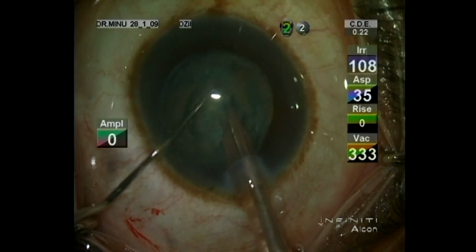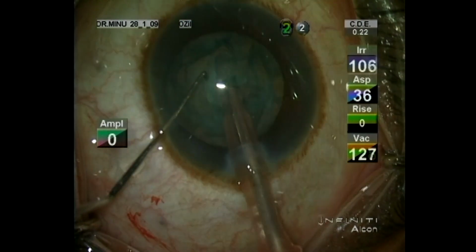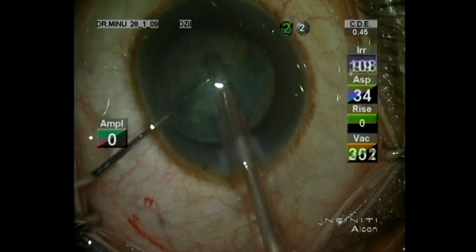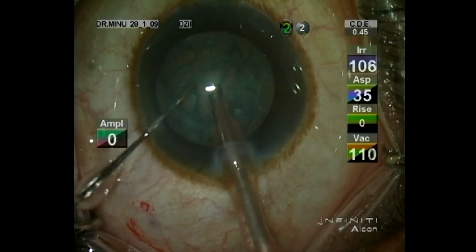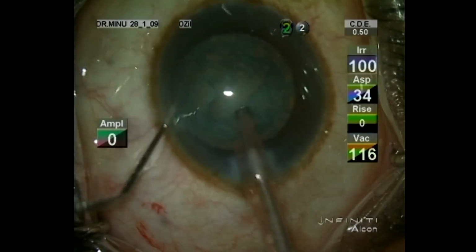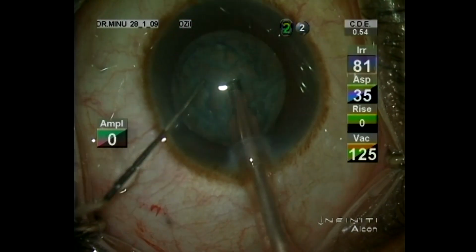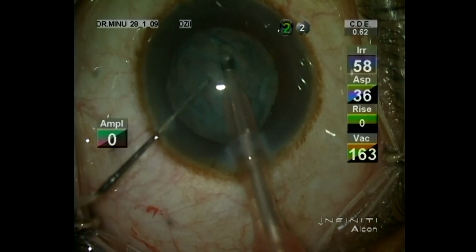So we were being told about soft cataracts, because we think soft cataract is easy, but soft cataracts are not easy, because of the central core, this is the problem. You try to just maintain a hold with a little bit of energy itself, it will eat off. So you rotate, you hold another piece. Again you rotate, it will be lost. So you lose the central core and you get a bowl of epinucleus in the periphery and you won't have anywhere to hold, it doesn't come out, it keeps rotating inside the bag.